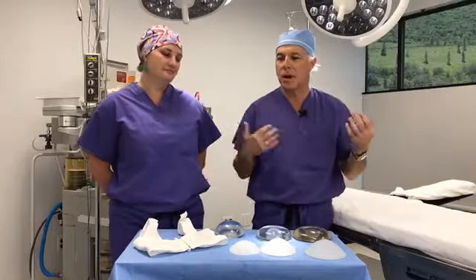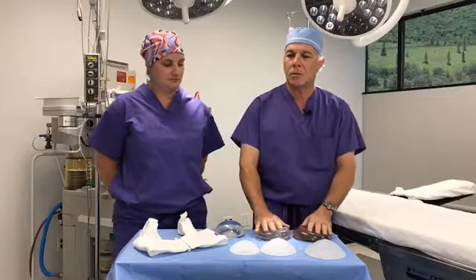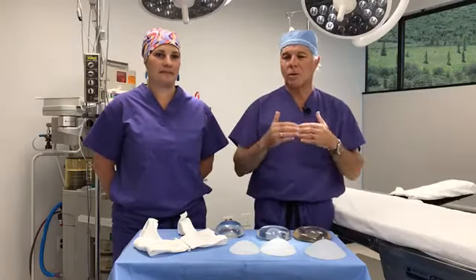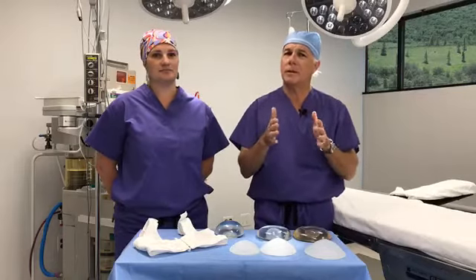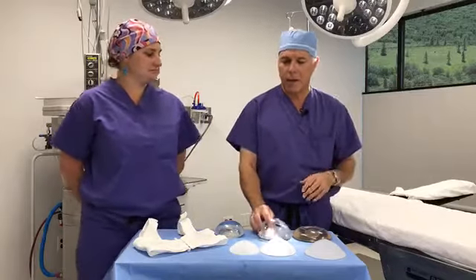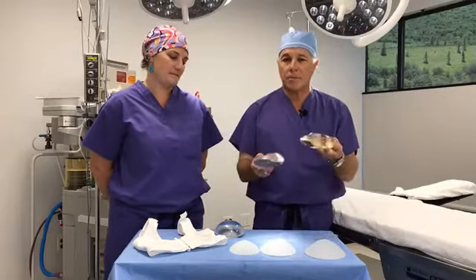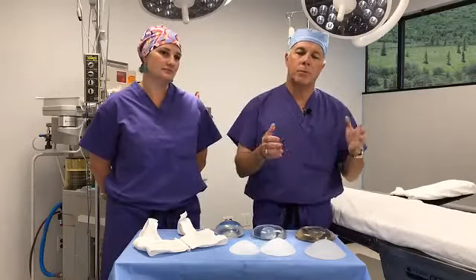So it gives people a chance to try on some different outfits and fine tune that, with the understanding that it's still our job in the operating room to make sure that the implant's going to fit and give you a natural shape. So usually within one size up or down of the patient's expectations, we have a little bit of leeway, because the way we do the surgery is the patient's asleep on the operating table, we make a pocket, and we have sizers, which are temporary implants that we can put in, sit you up, make sure the pocket's right, try perhaps a different shaped implant, to make sure that we're getting the optimal shape, and then we can put in an implant.